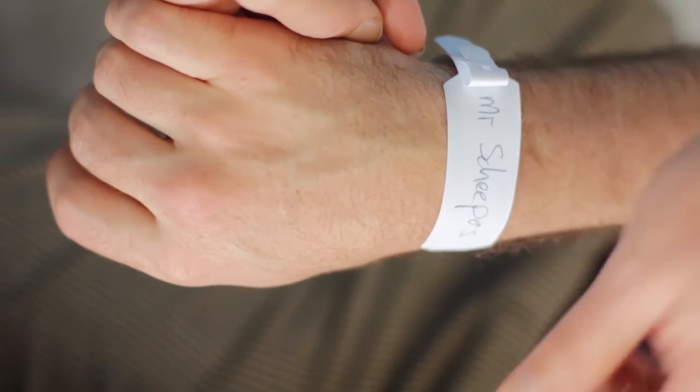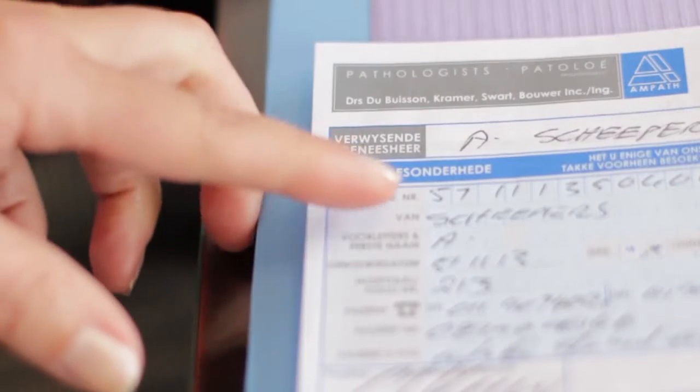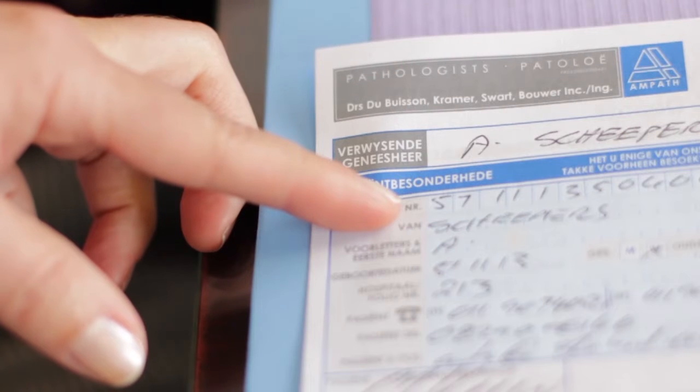Before starting this phlebotomy procedure, first, greet the patient and introduce yourself. Pause to confirm that you have positively identified the correct patient and that you are performing the correct procedure.